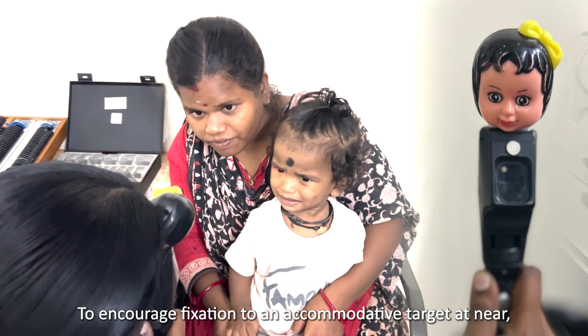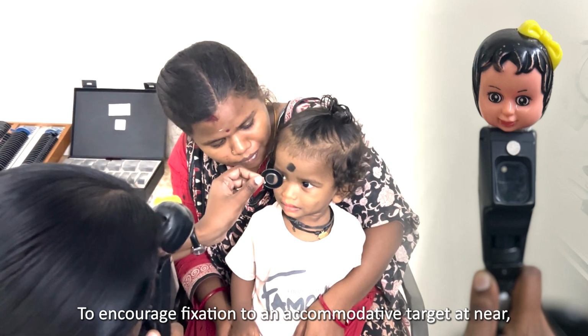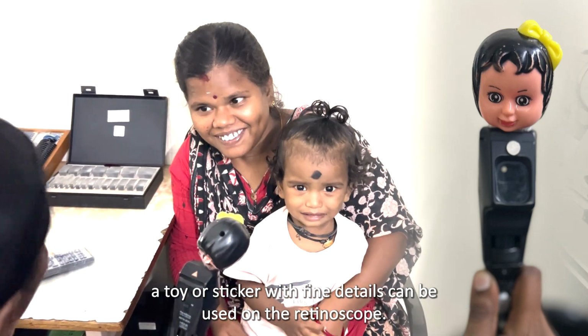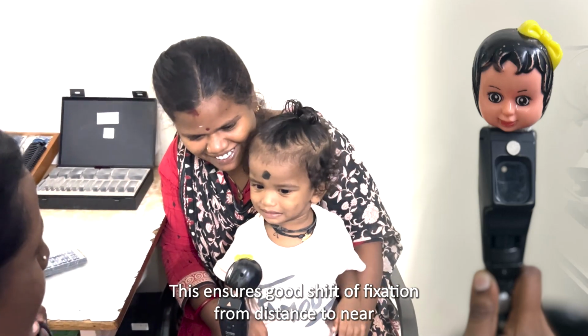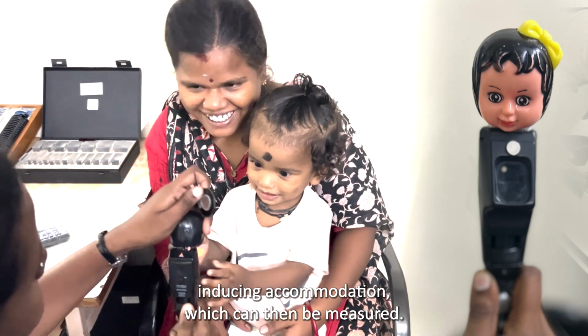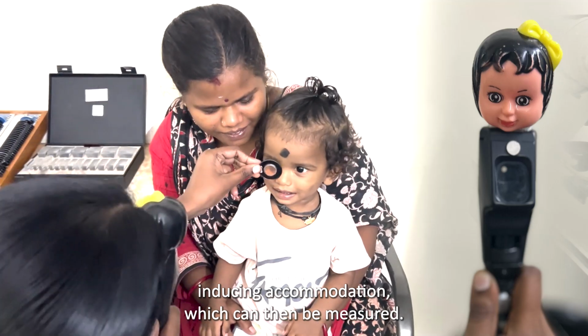To encourage fixation to an accommodative target at near, a toy or sticker with fine details can be used on the retinoscope. This ensures good shift of fixation from distance to near, inducing accommodation which can then be measured.